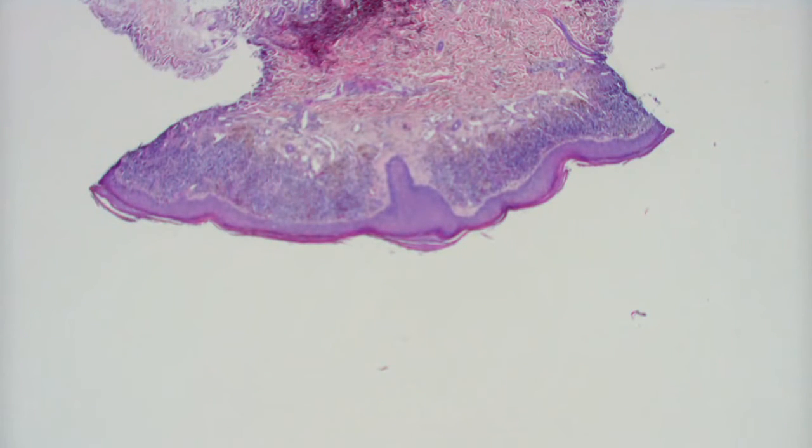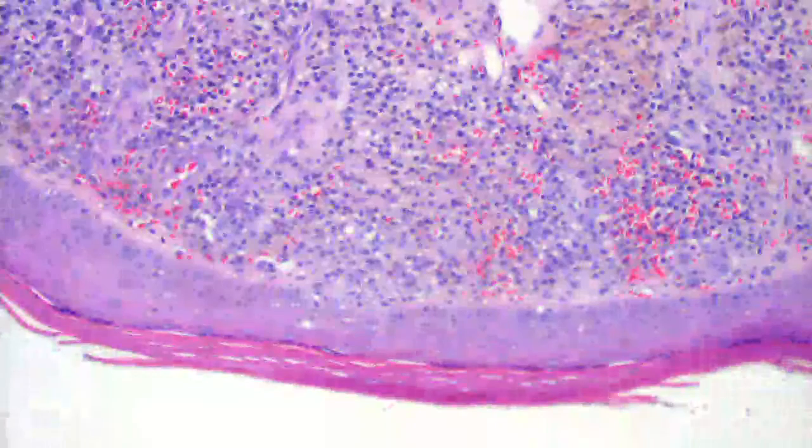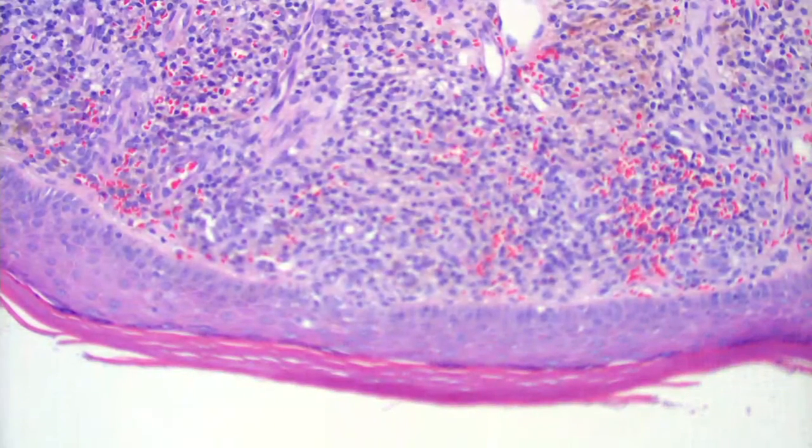So within the non-neoplastic things that I thought about, I thought of stasis dermatitis. But there's no eczematous changes. Good. So then, another thing that could be is PPD, pigmented purpuric dermatitis. Good. And within those, Gougerot-Blum is the lichenoid one. Yeah, excellent. Gougerot-Blum, or lichen aureus, which is kind of another name for that.